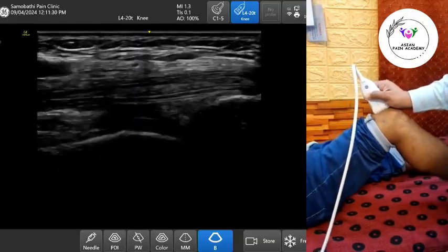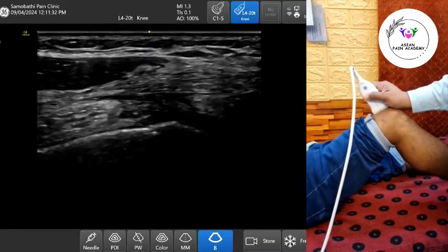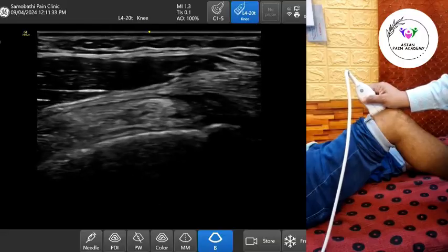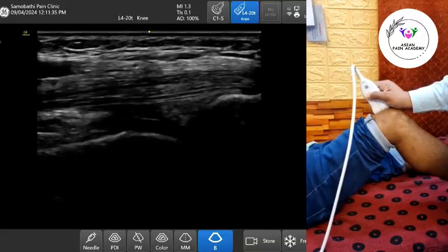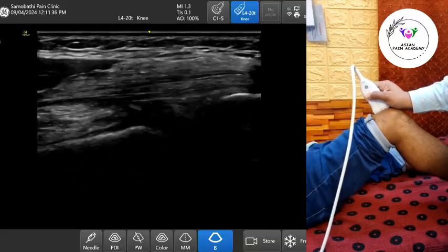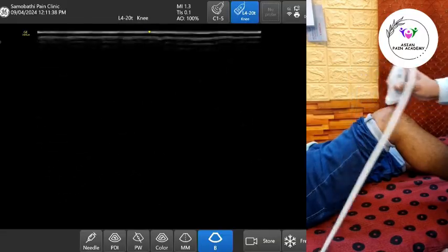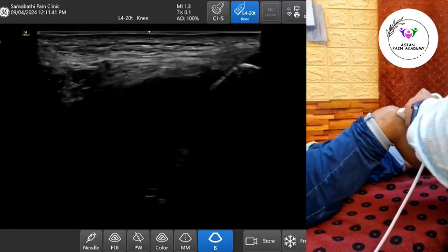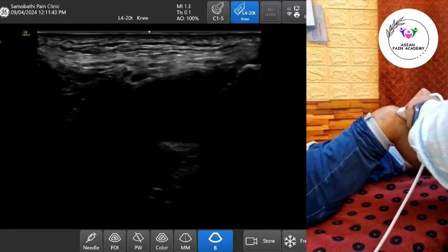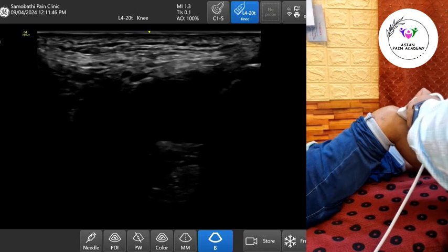If present, infrapatellar bursitis will appear as a well-defined fluid-filled pocket beneath the tendon. In chronic cases, you may also see septations or synovial thickening. Always compare with the contralateral side, especially when fluid is minimal or asymmetric.